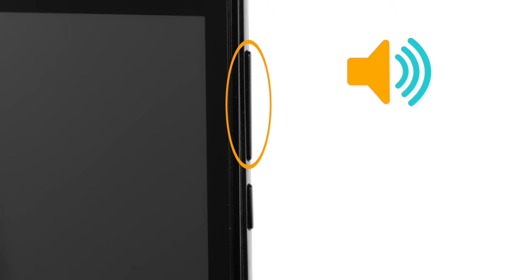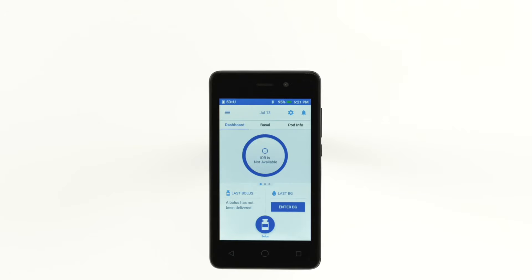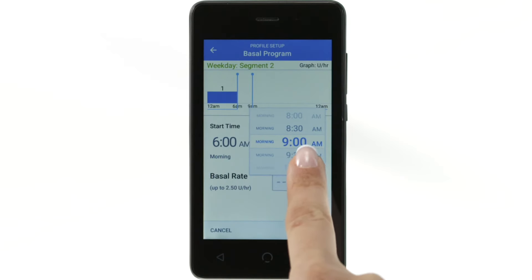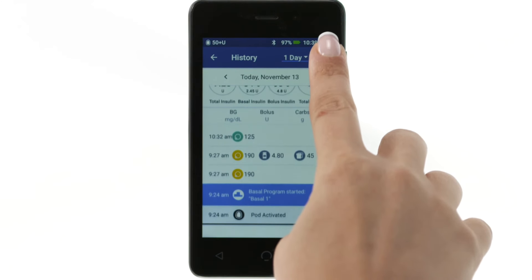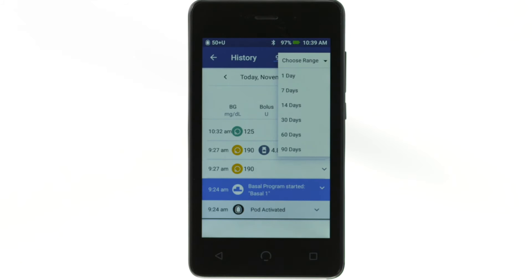The larger of the two buttons controls the volume. You may increase the volume or decrease it down to vibrate. On the top of the PDM, you will find the micro USB port for charging or data exchange. All personalized PDM settings must be entered into the PDM before use. The PDM will keep a 90-day history of all blood glucose entries, insulin delivery, and any other actions that may occur.